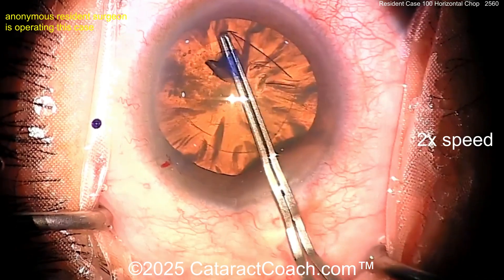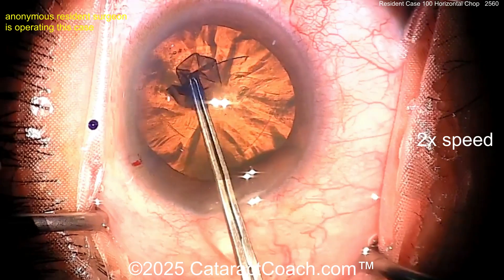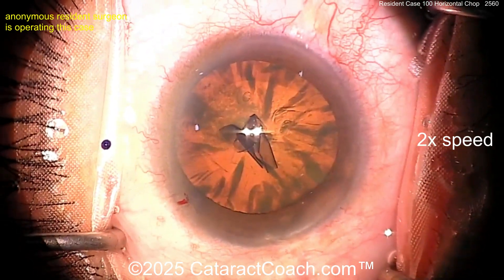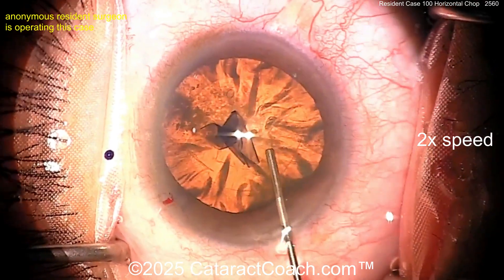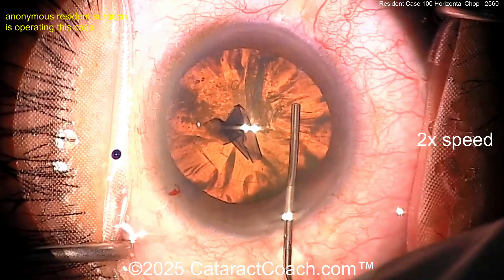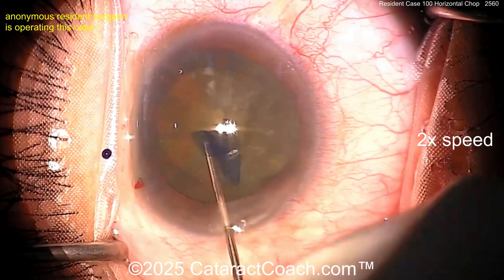Look at the pivoting within the incision — this is really well done for a hundred cases. I'm blown away. This new generation has the ability to really surpass previous generations. The amount of material you have to learn from, like CataractCoach and other videos online, is really amazing. What a beautiful rhexis — that's just about five millimeters, I'm guessing.